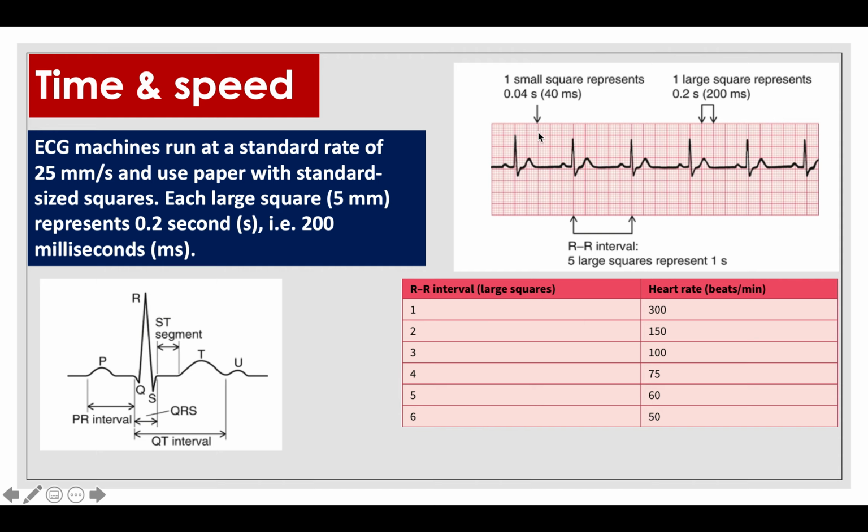Now, the main thing I want you to know from here is simply that an ECG complex consists of 5 different parts. So we have a P wave, a QRS complex, then an ST segment, a T wave, and sometimes a U wave, and then this repeats. This cycle keeps on repeating in a normal, healthy patient. When a cardiologist or a physician looks at an ECG, people in physiology and so on always describe the PR interval, the QRS complex and its duration, the ST segment, the QT interval, etc.